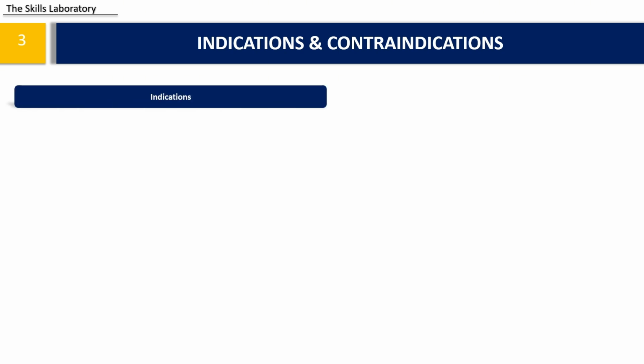For the indications, number one is again bowel decompression and GI obstruction. Because of the GI obstruction, there is no passage of food and materials in your GI tract, especially in cases wherein a patient has strictures or masses within the GI tract. So we use NGT or OGT in order to decompress your gastrointestinal tract.